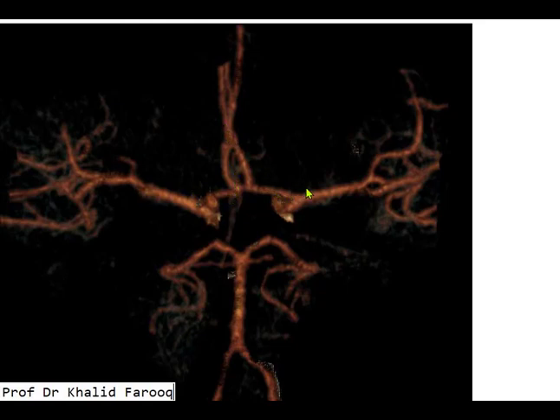This is a 3D image of the circle of Willis. We can see the basilar artery, posterior cerebral arteries, and anterior and middle cerebral arteries. Overall, there is no abnormality in the major vessels.